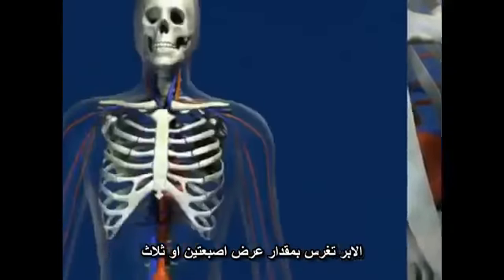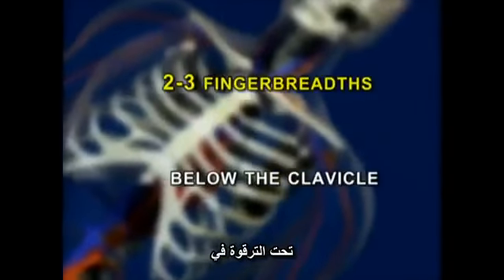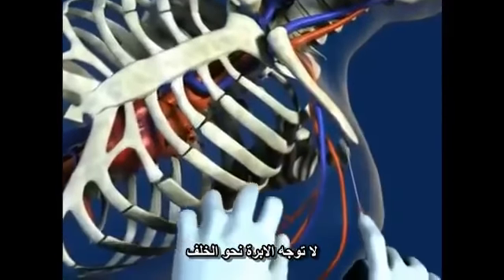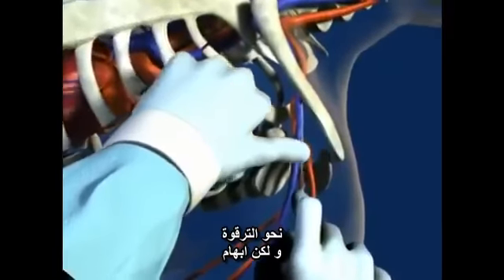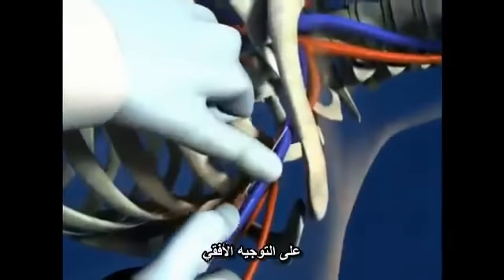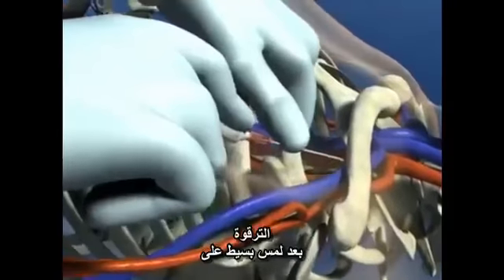The introducer needle is inserted 2 to 3 finger breadths below the clavicle at the previously identified insertion site. The needle is not aimed posteriorly. Instead, the needle is inserted and aimed at the clavicle, but the thumb of the opposite hand is used to depress the needle down while maintaining a horizontal orientation. The needle is advanced until the clavicle has been encountered.